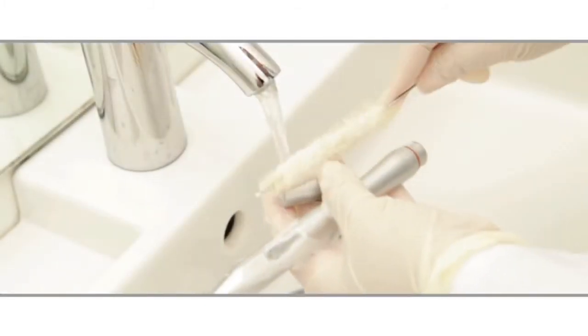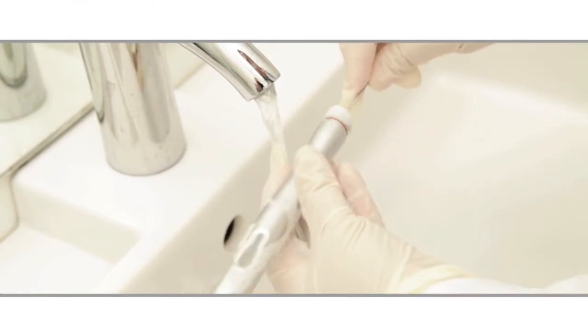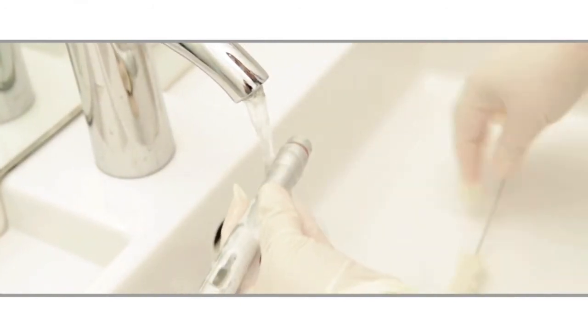To begin, use a soft bristled brush to wash the empty sheath and end cap with soap and water to remove any debris. You will need to thoroughly rinse with water prior to sterilization.